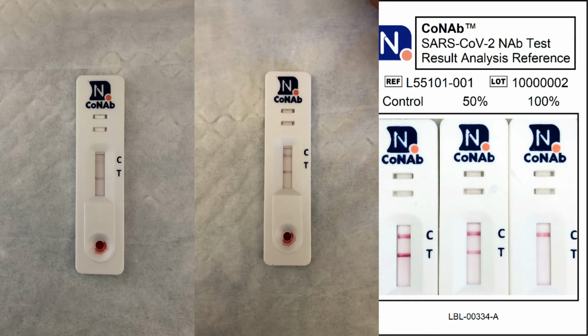Look on the back of the cartridge bag or outer box to find the CoNAb result analysis reference containing an image of 3 different strips. Visually compare the results obtained or scan the cassette with a strip reader.